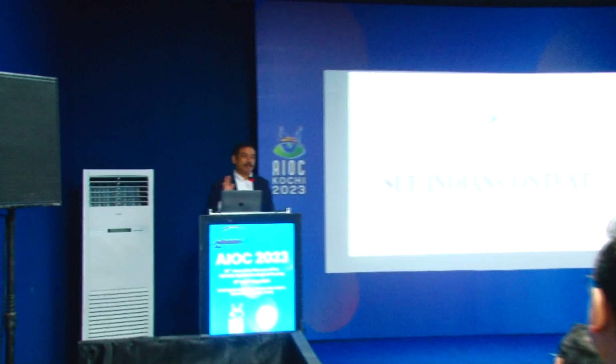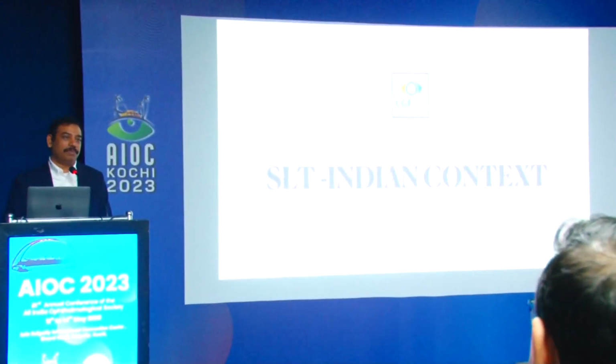The comfort matters. You have your back pain, all that. You can just lie down and do your virtual perimetry. But at this moment, some of us are still not willing to accept that virtual perimetry is doing a good job. For me, I feel it is really doing a good job. People start complaining about whether it has follow-up data. It does have its own follow-up. At present, mentally, we are just not willing to accept it. That's my feeling.